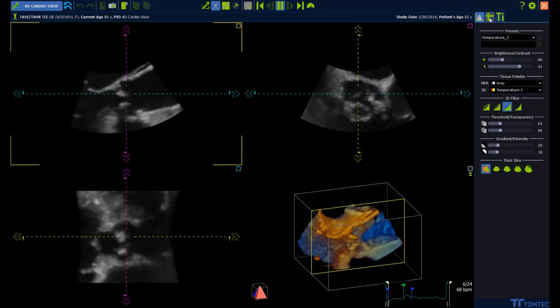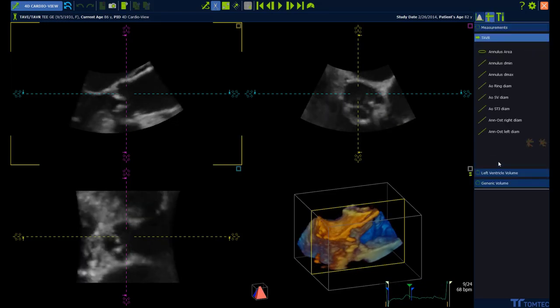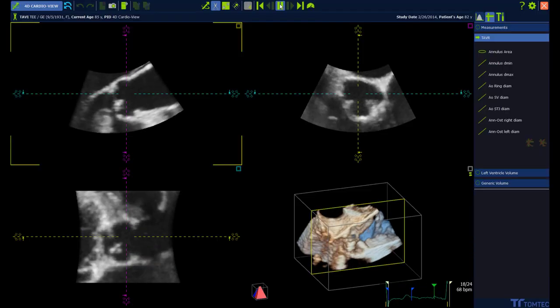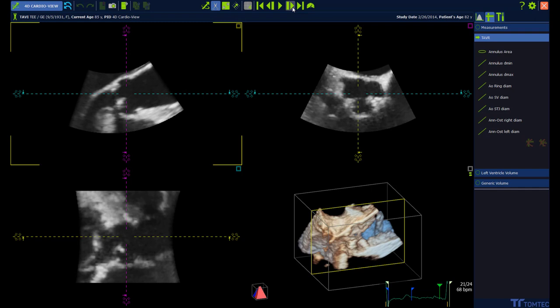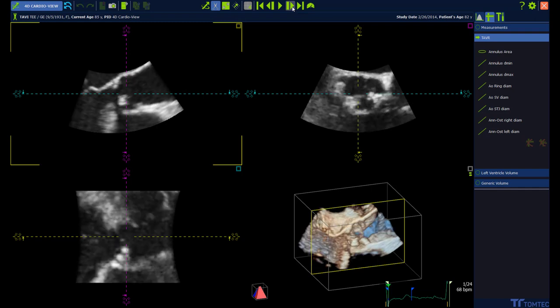Inside the measurement menu you find the submenu for TAVR measurements. Select the frame where to measure. Stop the loop and click the next frame playback button until the mid-systolic frame is displayed.